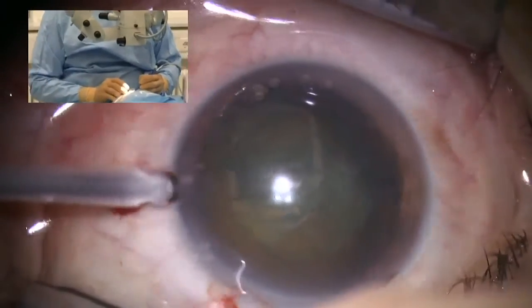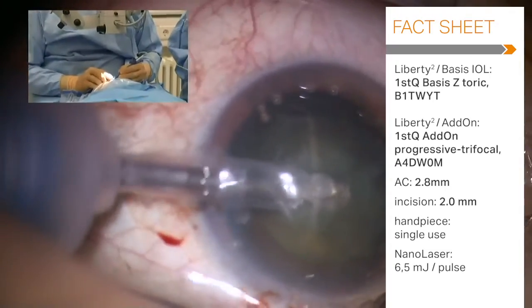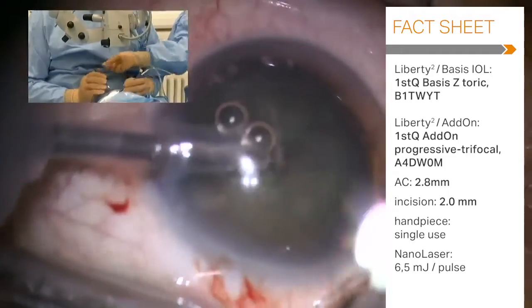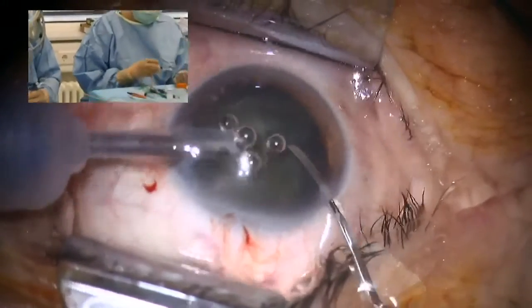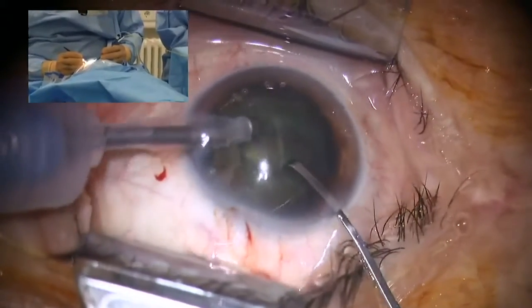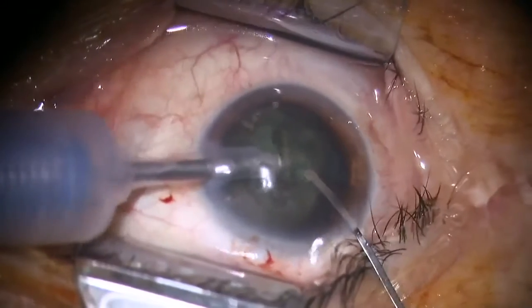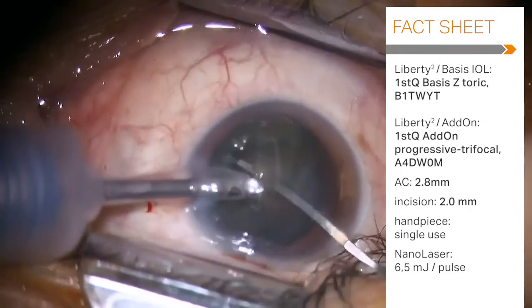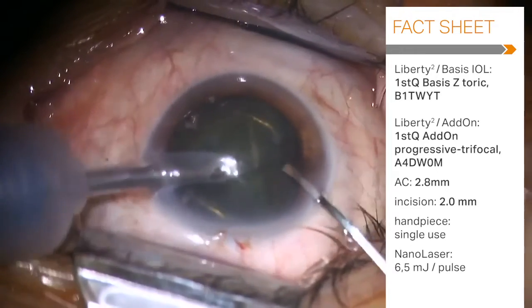You normally need, there was a question, what size of the capsulorhexis you need. I normally aim for 5 mm. Now we try to remove the lens. The system we do so is the nanolaser from the IRC company, which I prefer in our premium cataract patients throughout the last 6-8 years now. The system totally avoids any amount of thermal or mechanical damage during the process of the removal of the lens.